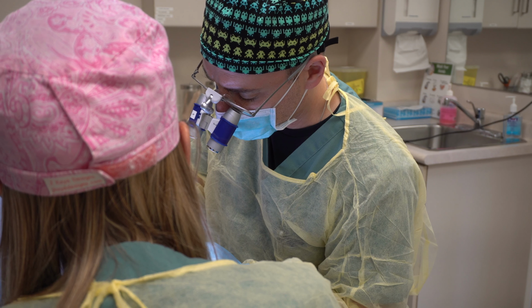Today we're going to be talking about FUE, or follicular unit excision, which is a hair transplantation procedure. We used to refer to this as follicular unit extraction. The name was recently changed to emphasize the notion that this is really a surgical procedure that's best done by an experienced surgeon. In a FUE procedure, we use a small motorized punch.